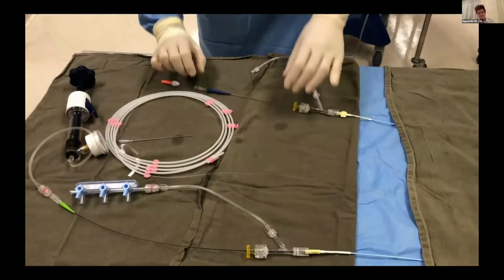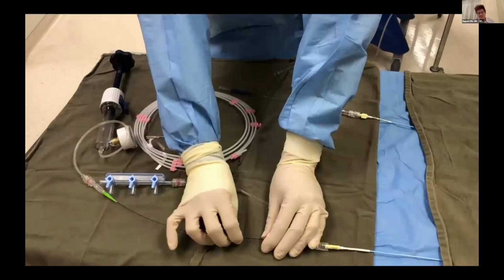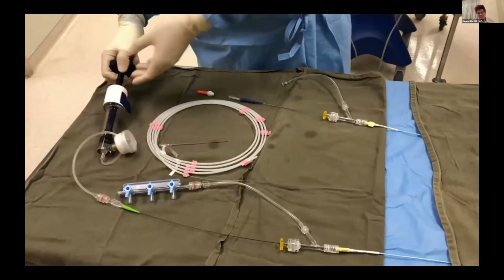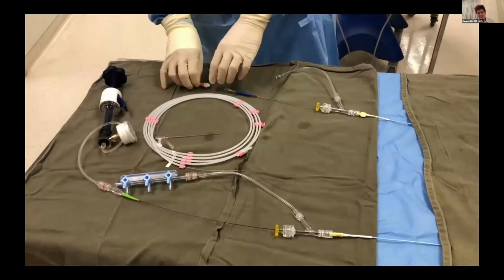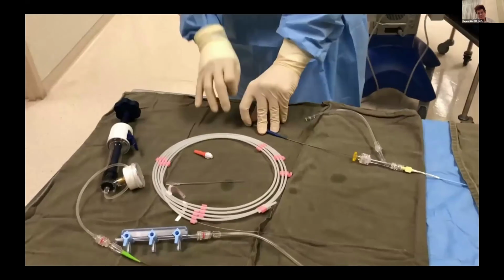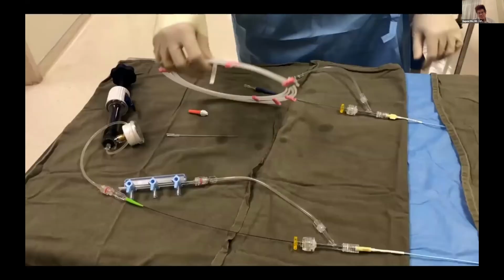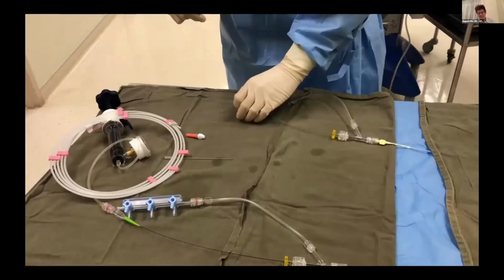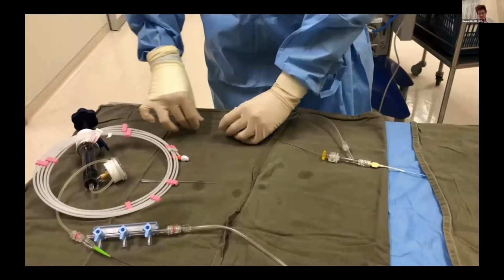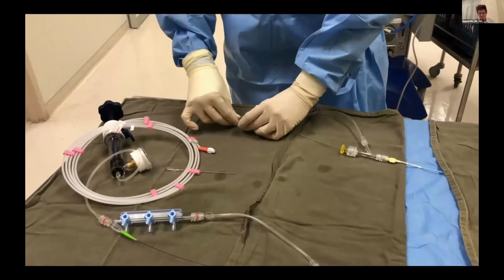At this point, we usually recommend you release the trapping of the guide wire and push the balloon forward a little bit and trap instead the retrograde Corsair. This stabilizes the position of the retrograde Corsair as well as stops back bleeding from the antegrade side. Then you remove the retrograde CTO wire and instead replace it with an RG3 wire. So we push the RG3 wire all the way through the retrograde system, and under fluoroscopic guidance, we check when it begins to reach the antegrade guiding.